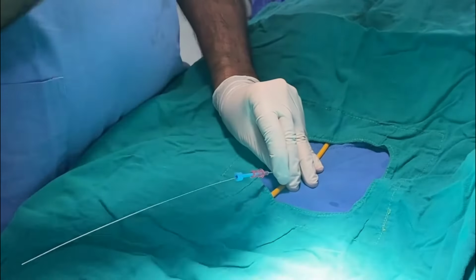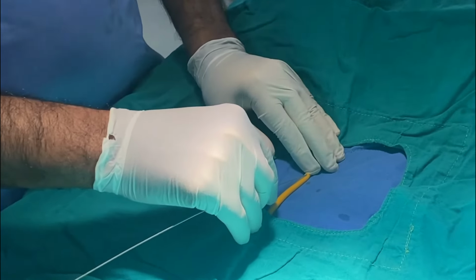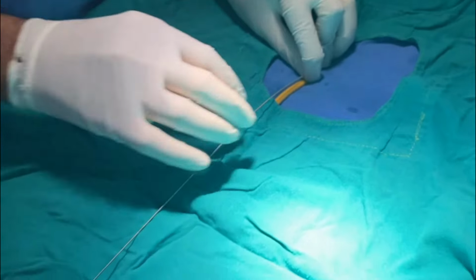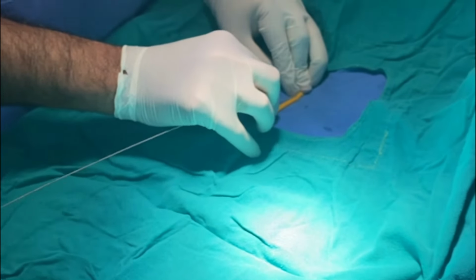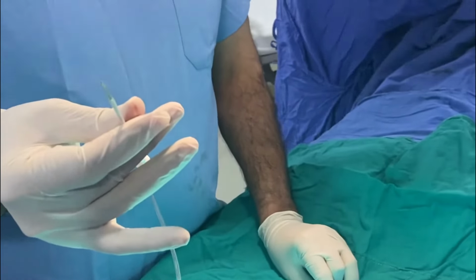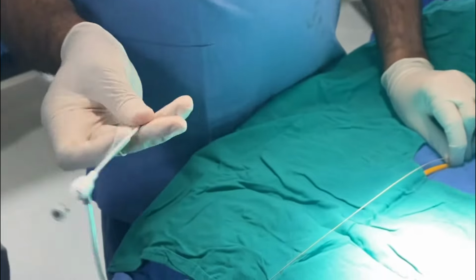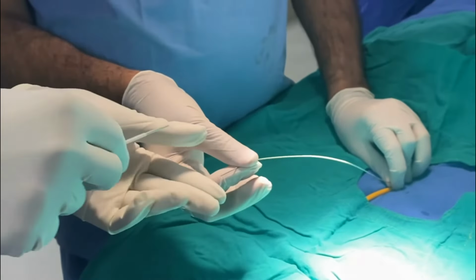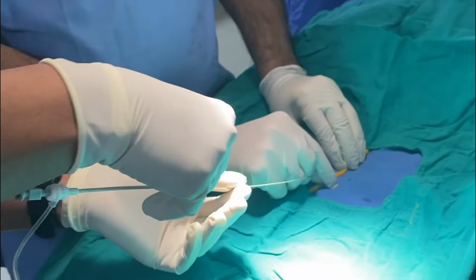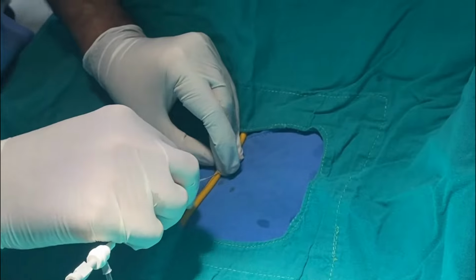Once it is inside the artery, do the fluoroscopy and identify that it has gone inside. Then press the artery like this, and you can withdraw the needle and hold the wire. So it comes out like this. Now the wire is inside, and this is the puncture spot. You can clean this, and this is the femoral sheath. It has got an introducer and the sheath. You can get the help of someone to put it, because your hand should always stabilize the artery, otherwise the blood will start leaking from the side. So press the artery like this with your two fingers so that the artery doesn't leak, and then slowly push it in.